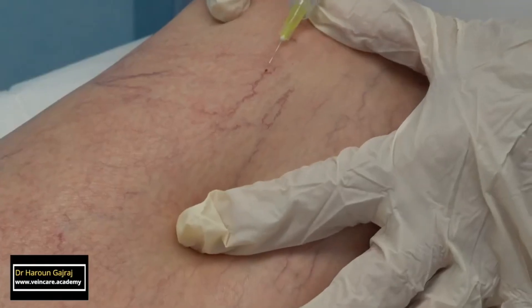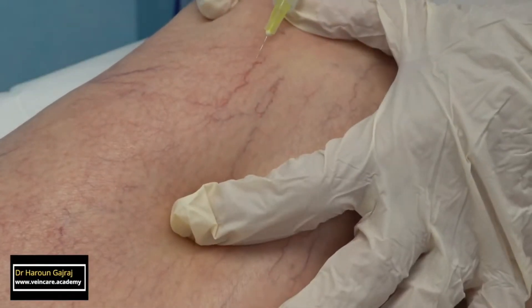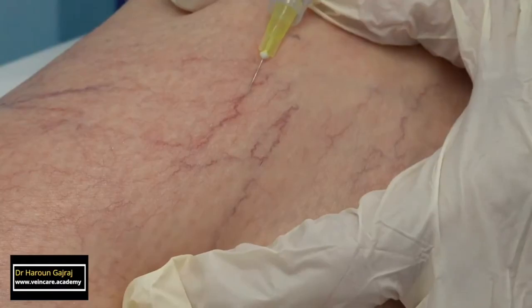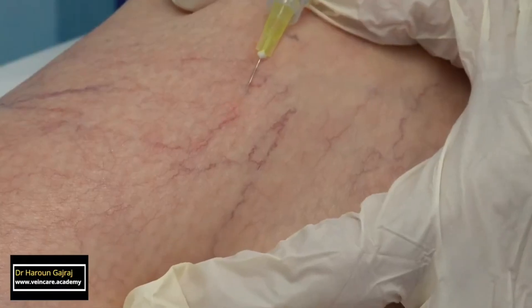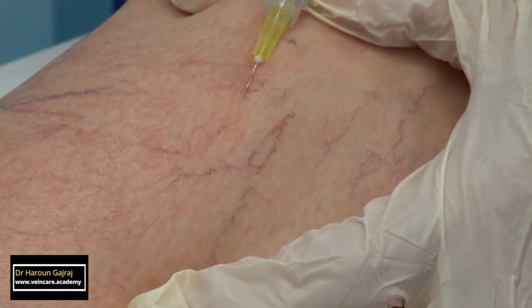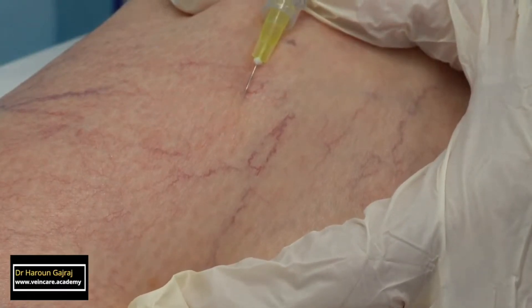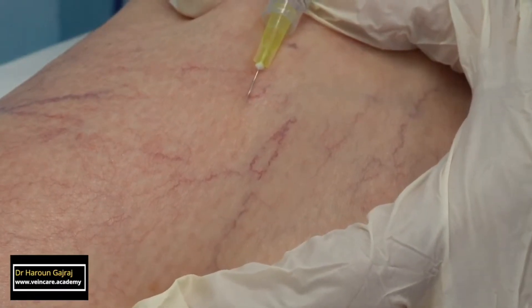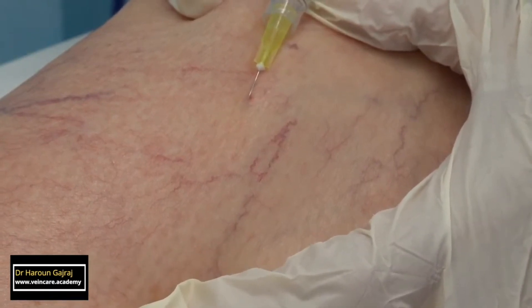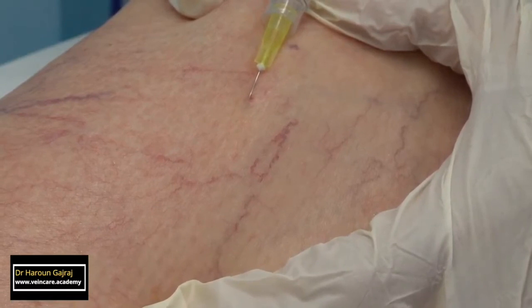Use a 30 gauge needle and inject with the bevel of the needle turned upward. Place the needle flat on the skin. The injection should be performed slowly and intravenous injection should be confirmed while the injection is in progress. Only inject when you are watching the needle tip. Successful intravenous injection results in blanching along the course of the thread vein.